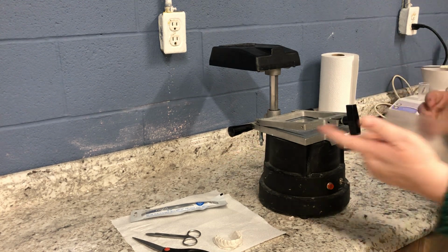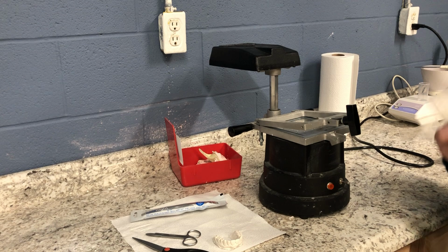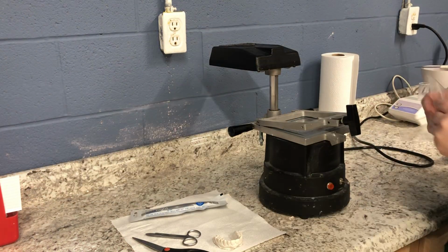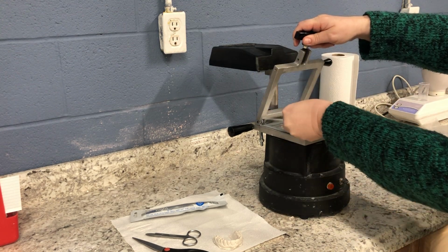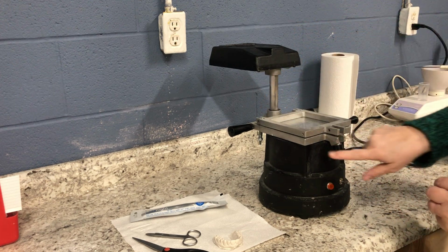So you don't want to put a pan underneath or near here, because if you have a wax bite in it, it can melt and distort. So we want to keep everything out of the way. This you lift up, and this bracket holds your bleaching tray material. Make sure it's nice and even.